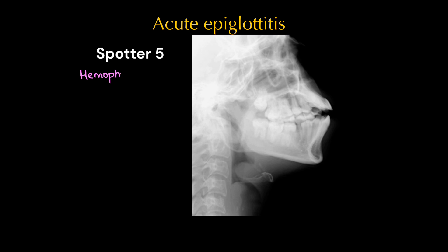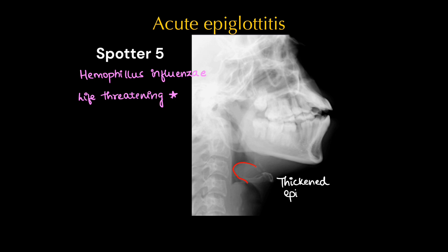This is a neat PG spotter case of acute epiglottitis. The most common cause is Haemophilus influenzae. It's a life-threatening condition and better to diagnose on X-ray. Here we can see a thickened epiglottis and aryepiglottic fold giving rise to the thumb sign.